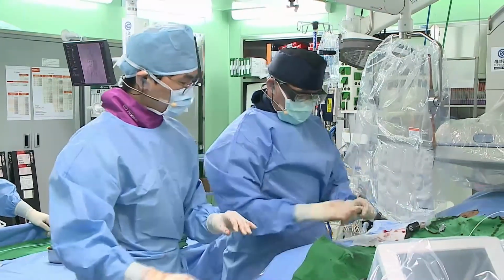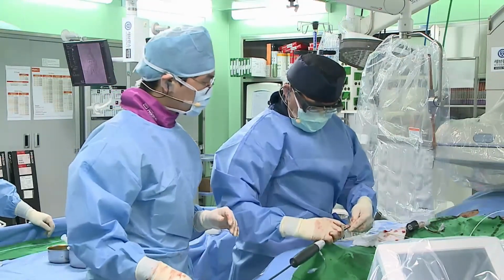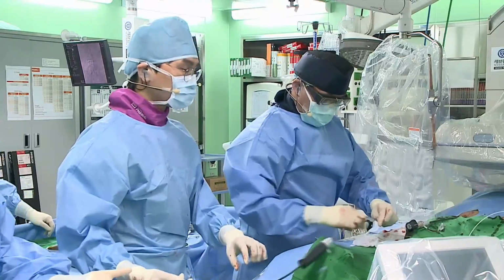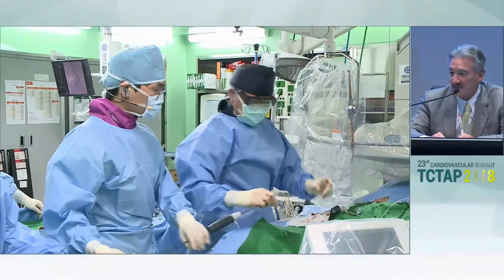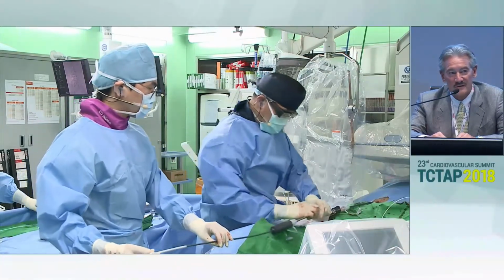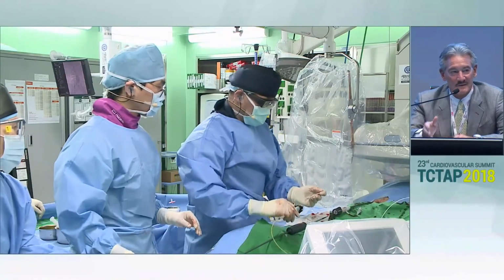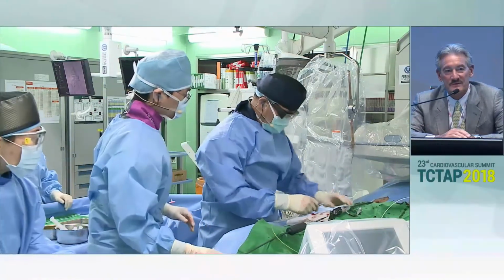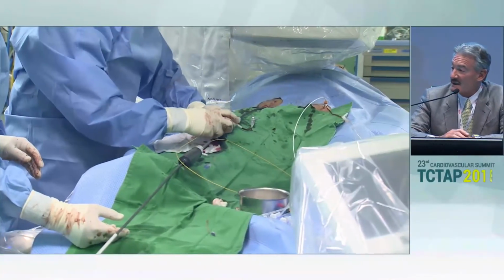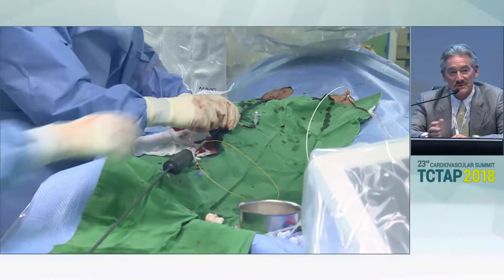Okay, so while he's working away, I see this as a well-indicated case. It's an aneurysm between 5 and 5.5 centimeters, which is the ideal size range to treat with an endograft. The outcomes databases, both Lifeline and Eurostar, clearly demonstrated that endograft performance, as far as aneurysm rupture-free survival, is best correlated with the size of the aneurysm at the time it is treated, being between 5 and 5.5, having better outcomes than when it's larger.